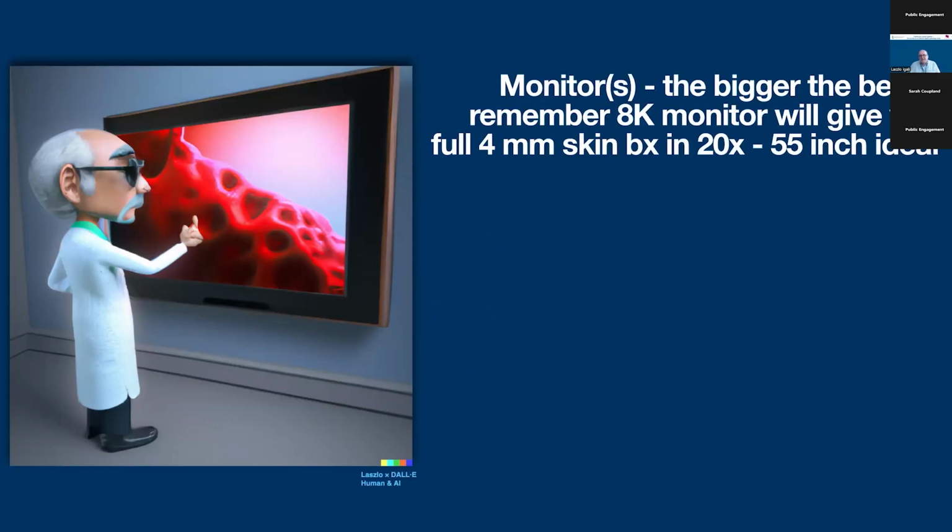Monitor, the bigger the better. If you look at an 8K monitor at 55 inch, which is my favorite size, a full 4mm skin biopsy, you will see it at 20x magnification. It's magnificent. You don't have to zoom or move around.